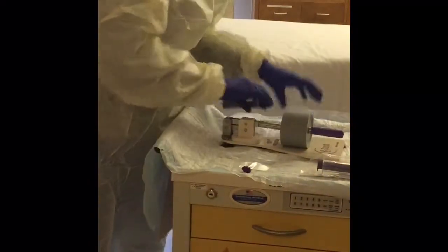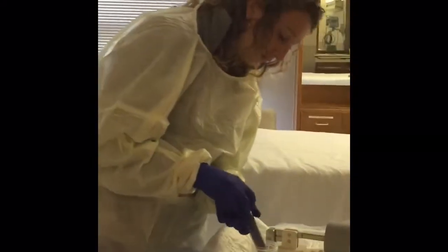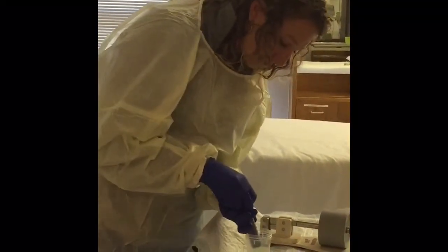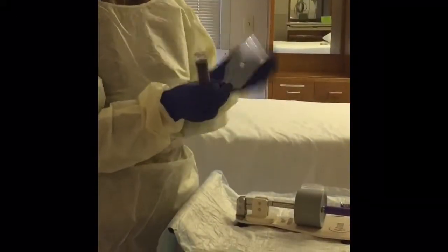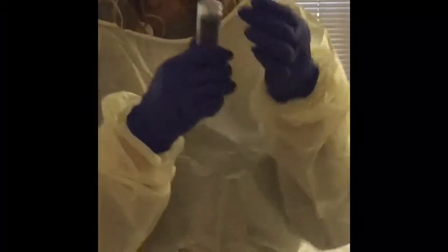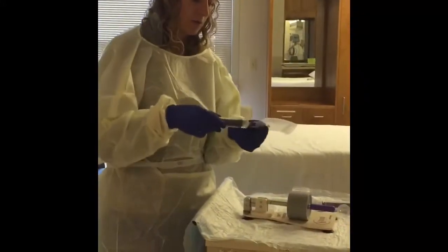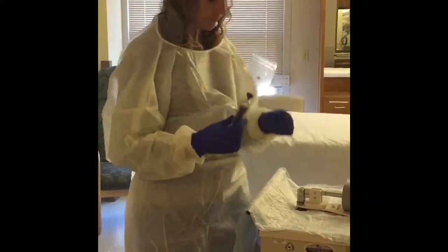Then I'm going to take my ENFit syringe and draw up about 5 cc's of sterile water. Then I'm going to attach the syringe to the ENFit nozzle on the pill pouch. I want to make sure that that's pretty well connected there. And then I'm not going to inject the water yet. The water's just going to stay just like that. Then I'm going to make sure that this zip and seal end is completely sealed.